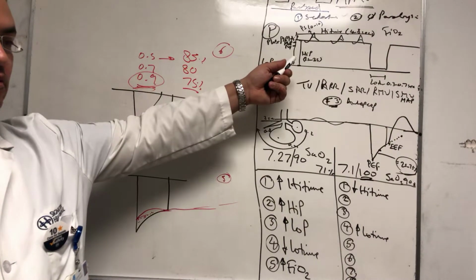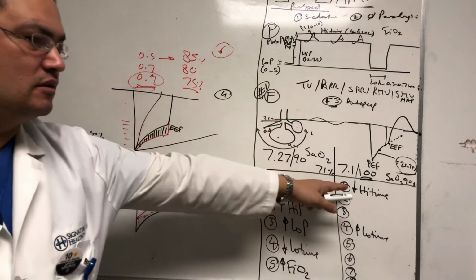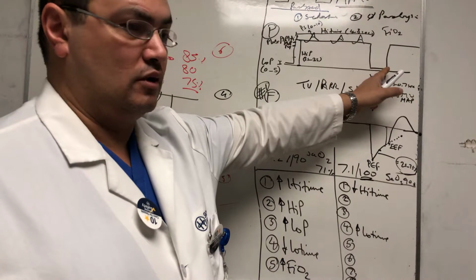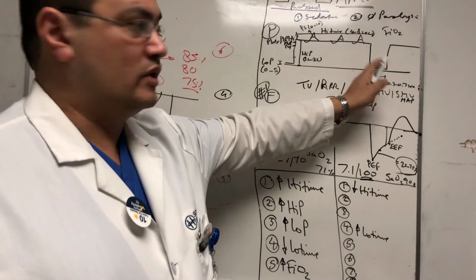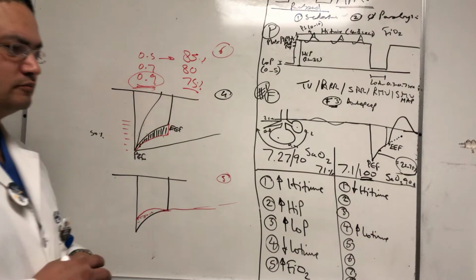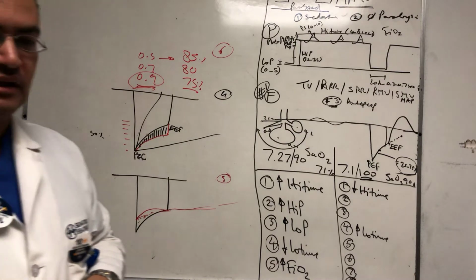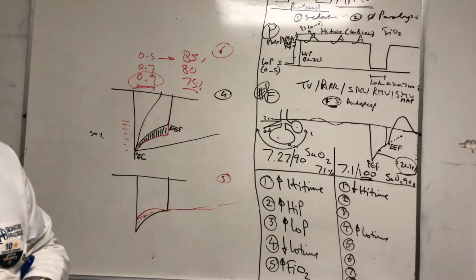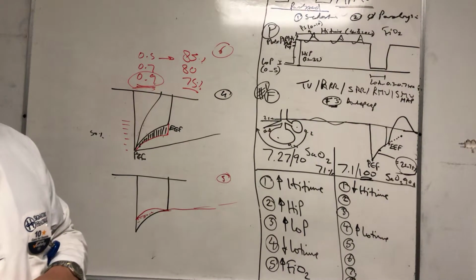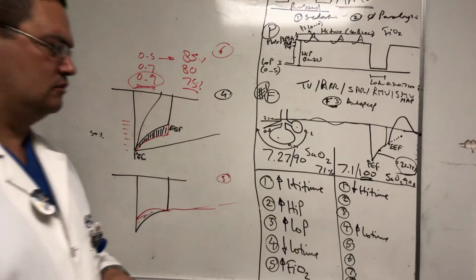What is the respiratory rate in this mode? Did we mention respiratory rate here? We didn't. There's no respiratory rate. So this determines the respiratory rate. We're not going to play with the classic APRV. We're not playing with the low time because the low time is so sensitive. We're going to play with the high time, and that will determine our respiratory rate. So if you're giving 6 seconds high time and 0.5 low time, you'll probably have 9 breaths per minute. If you decrease it to 4, you're probably getting about 13 or 14 breaths per minute, and so on.